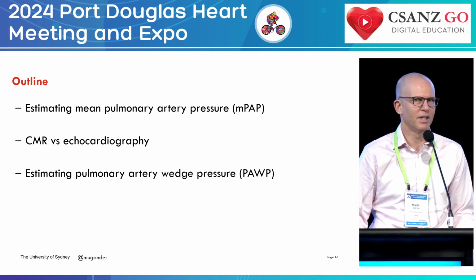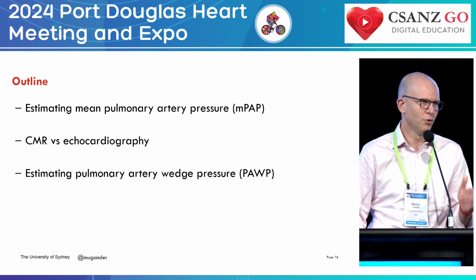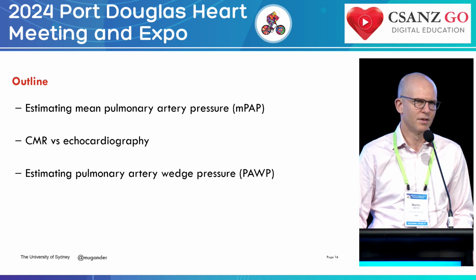And pretty much we can nail this in a non-contrast, free-breathing 10-minute scan by CMR, and we're trying to evaluate that now prospectively. So if you at your institution are interested in this, we'd be happy to help out. It's not impossible to do, and we welcome collaborators if such are interested. I think we'll see a future with a non-invasive right heart cath by MR in patients with sinus rhythm. Doesn't work very well for atrial fibrillation as of yet, and it's a bright future on the horizon.